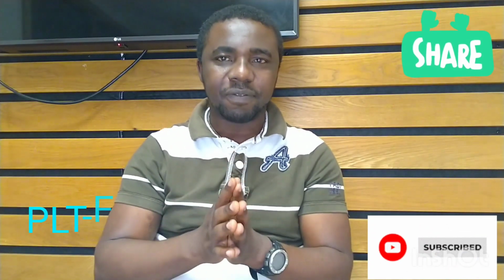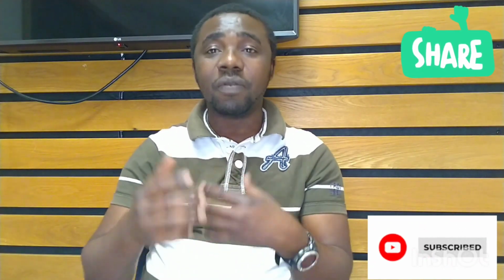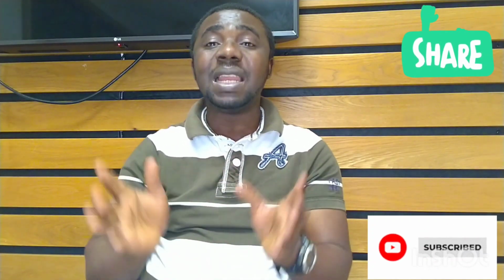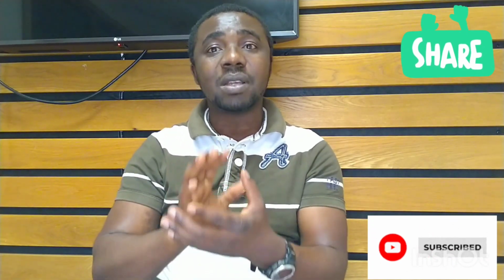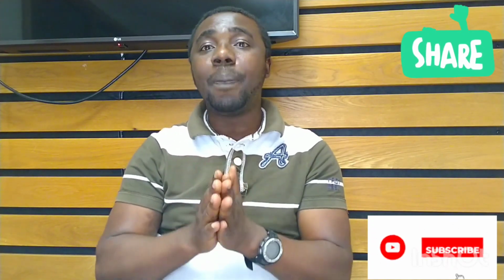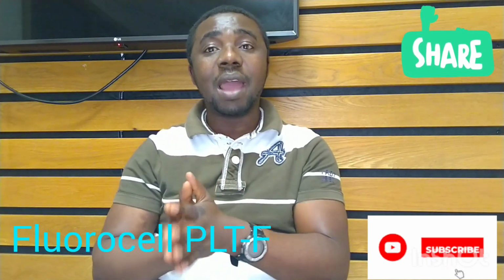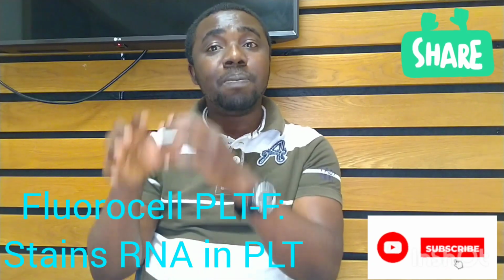What the Platelet-F does, basically, is that following the lysis of the blood, nothing will happen to the platelet. The platelet will still remain intact after the lysis of the whole blood. But what will then happen is that with the help of the fluorocell Platelet-F, that will then stain the RNA of the platelet.